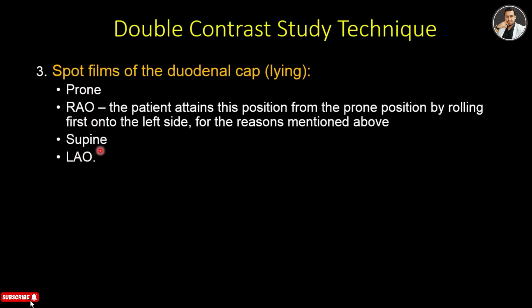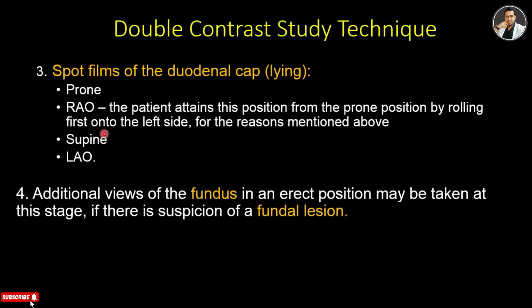So as the barium reaches the duodenal cap, your barium meal study has finished. That means the barium is entering the small intestine. And additional views of the fundus in an erect position may be taken at this stage if there is suspicion of a fundal lesion.